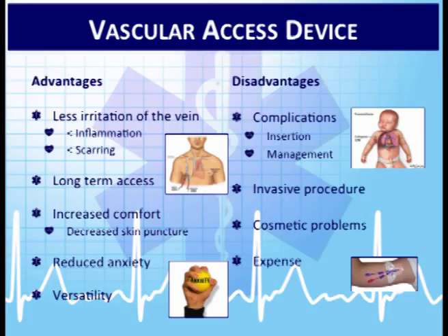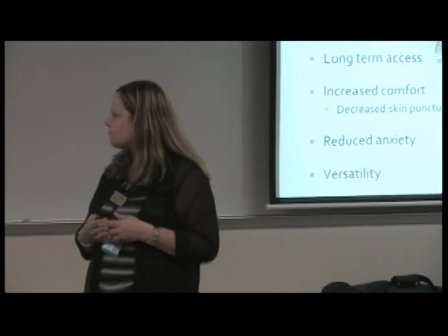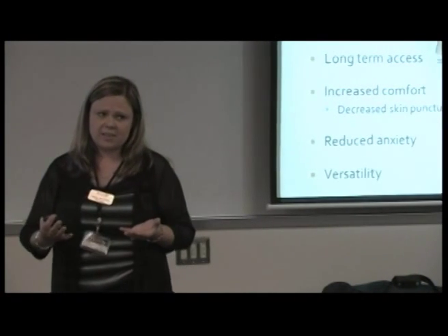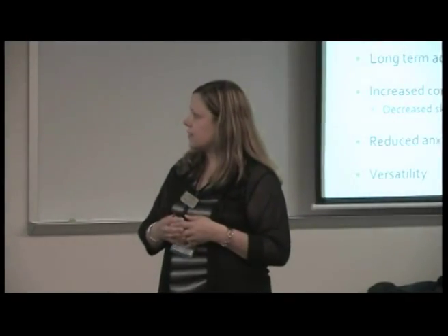Reduced anxiety. Sometimes people are very fearful of getting blood draws done or IVs started. So if they can possibly be sedated for a central line, that's not always the case, but they might do that, and then they don't have to worry about that anxiety of going in for blood draws all the time. And it can be used for many different things: fluids, feedings, blood products.